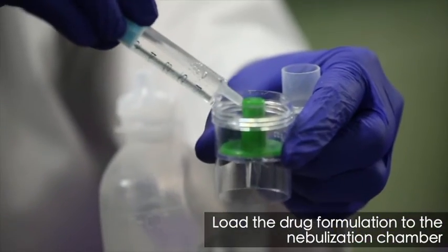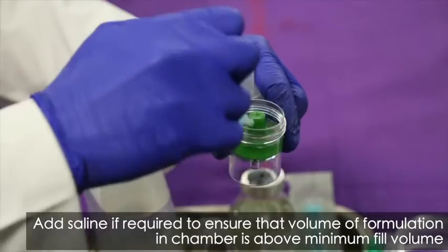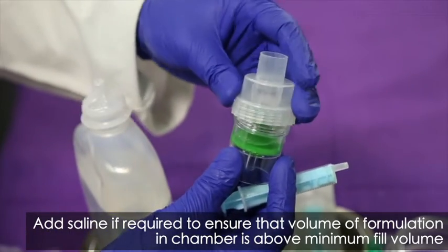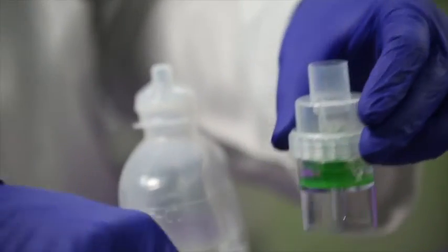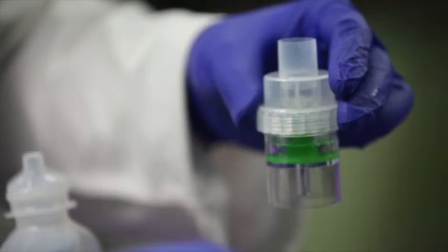Load the drug formulation to the nebulization chamber. Add saline if required to ensure that the volume of formulation in the chamber is above its minimal fill volume as shown.